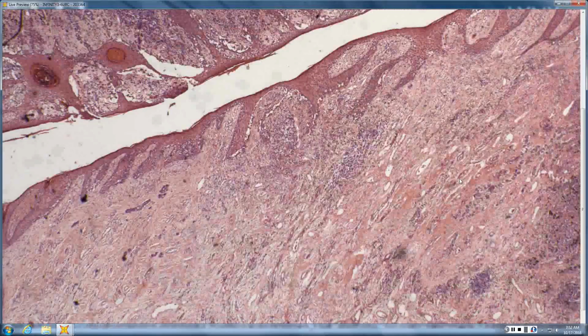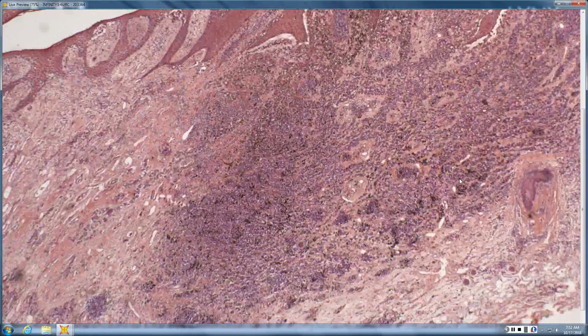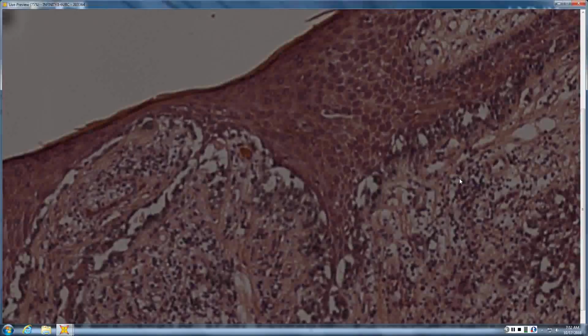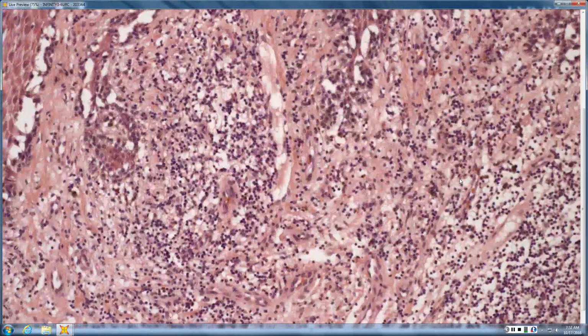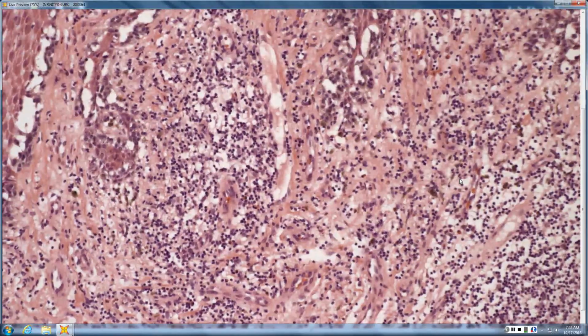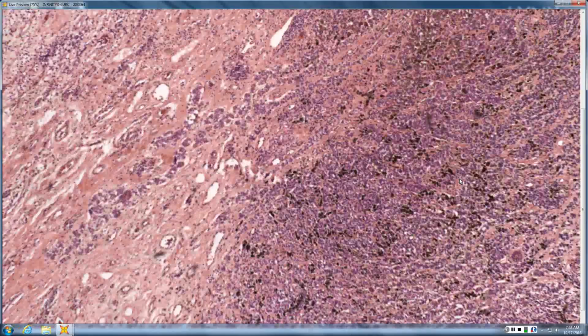I see an infiltrate in the dermis with some pigment incontinence. So infiltrate in the dermis, pigment in the dermis, at the junction. And so like a lining of melanocytes maybe? Lining up with melanocytes, eating away at the basal layer. Yes, and they're up in the arch instead of being at the tips and sides of the rete. Something bad. So something bad melanocytic, like invasive melanoma.